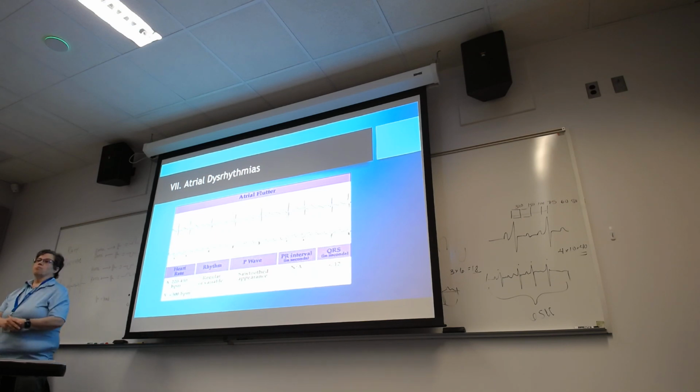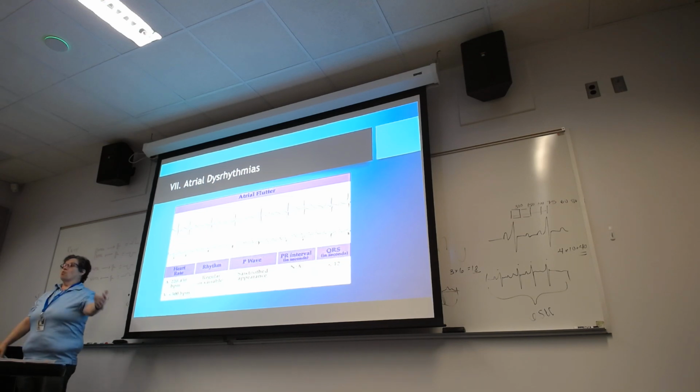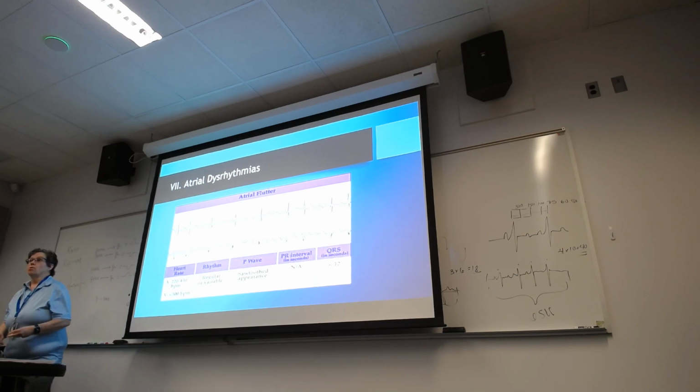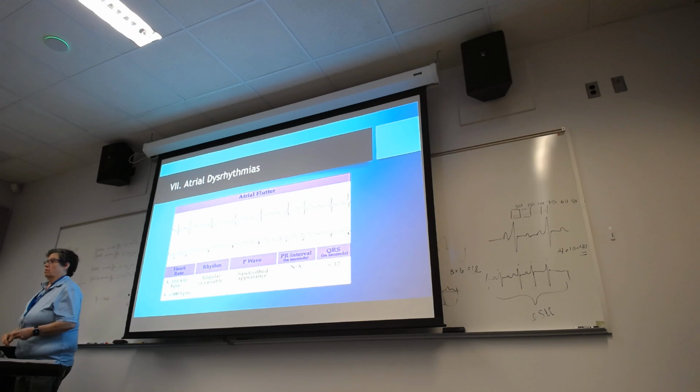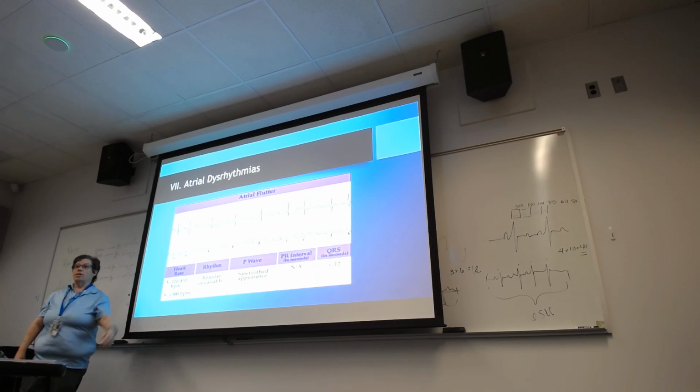And then the first time you get your patient that has underlying cardiac disease and a couple of bundle branch blocks, and you do a 12 lead and you're like, crap, that looks really bad. But they broke their arm, and that's their normal. The problem that we have is that we don't have anything to compare to what their normal is. Whereas the hospital can pull them up if they've ever been there and look at their last EKG. So sometimes it'll look really horrible, and you'll be like, oh my God, I never saw one like that in cardiology. Okay.